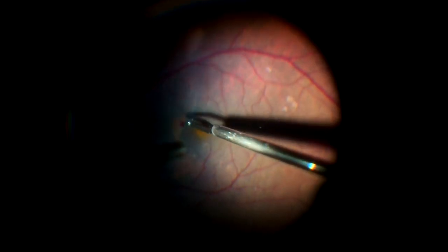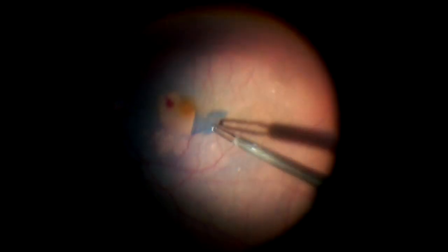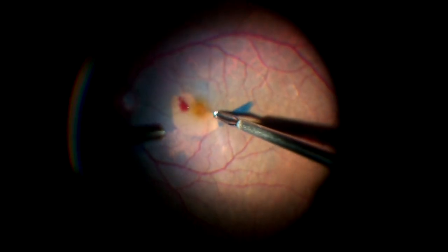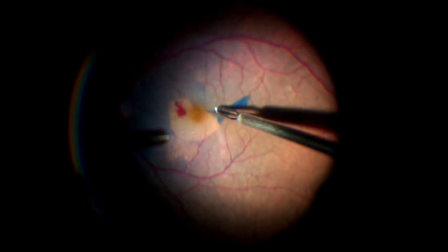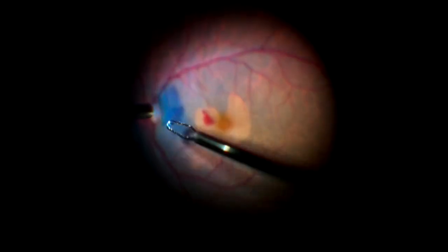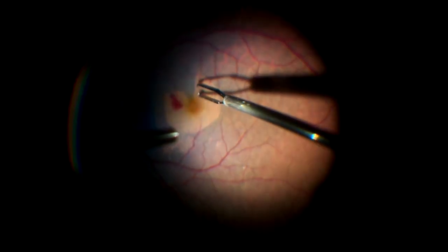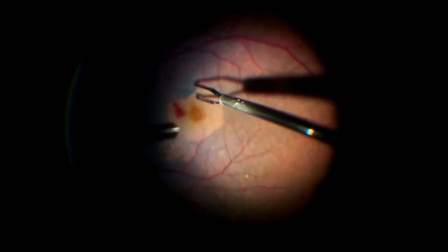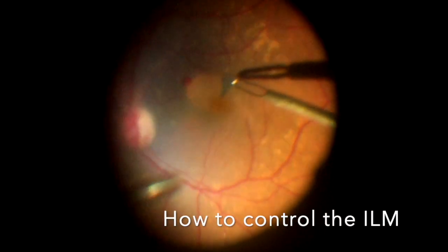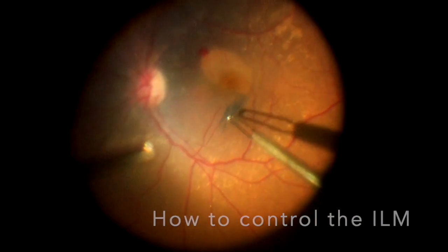This is very close to the fovea, and sometimes in patients who are on antiplatelets or anticoagulants, post-operatively also these bleeds may create troubles because you cannot do anything to reduce the bleed from there. It's very close to the fovea. At this point of time, probably we can raise the bottle or increase the pressure so that it can be done.